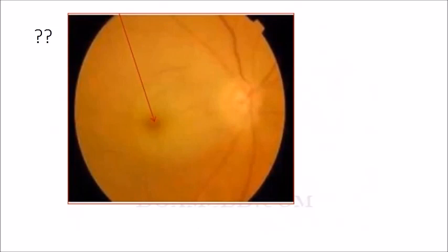Sir, pale retina with a red spot. Red spot is the macular area. So what is the spot name? Is there any name of the spot? Yes, sir. Anybody can recall? Anybody can help Dr. Farial? He is struggling with the name. What is the name of the spot?